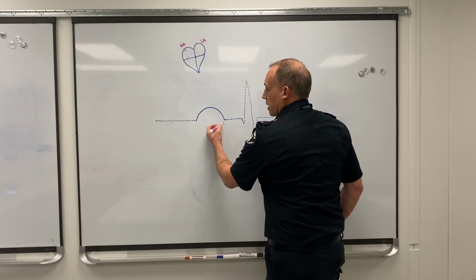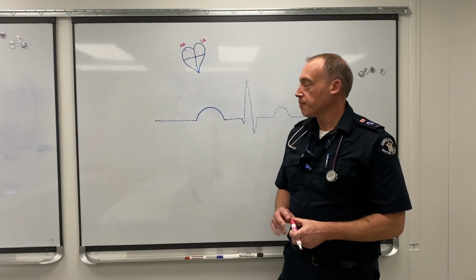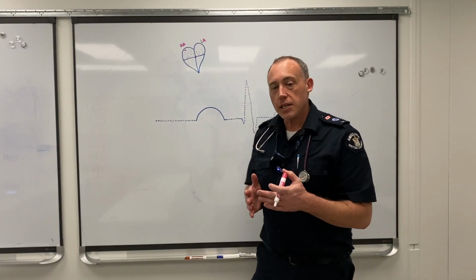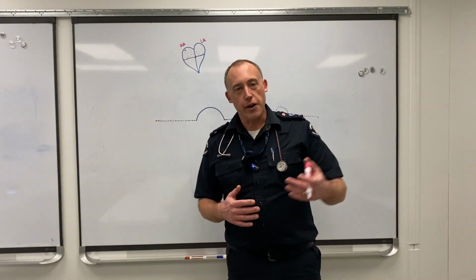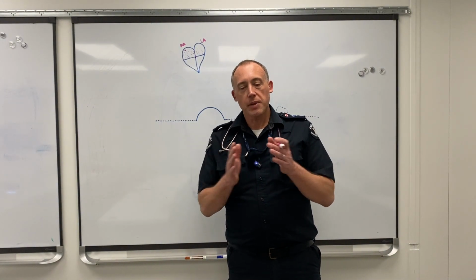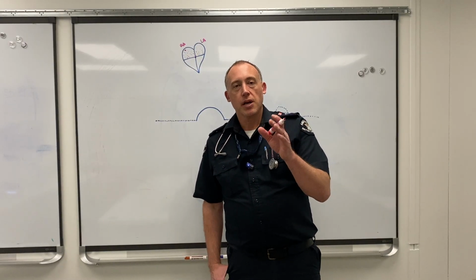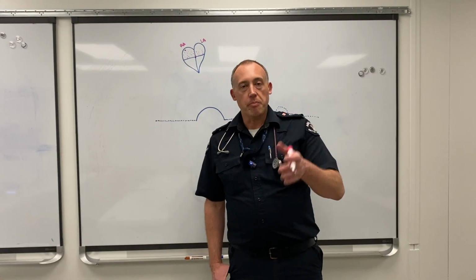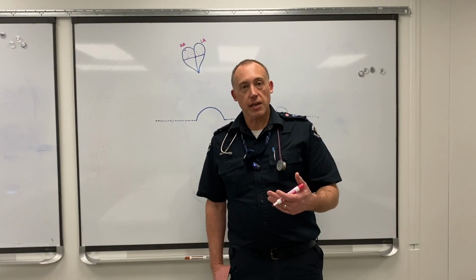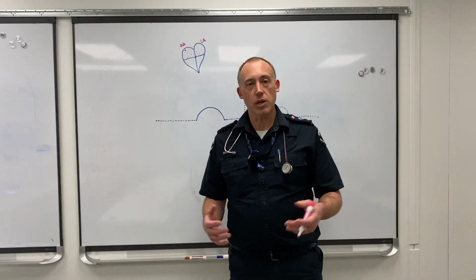Normally, this happens pretty quickly, usually about 80 to 120 milliseconds or less, usually less, and you can tell that by looking at the ECG paper itself. I didn't cover that earlier because it was a bit of a longer video, but ECG paper is just a function of time. It prints at a constant rate, and so each box represents a certain amount of time. The big lines represent 0.2 of a second, 1/5 of a second, or 200 milliseconds, because there are 1,000 milliseconds in 1 second.